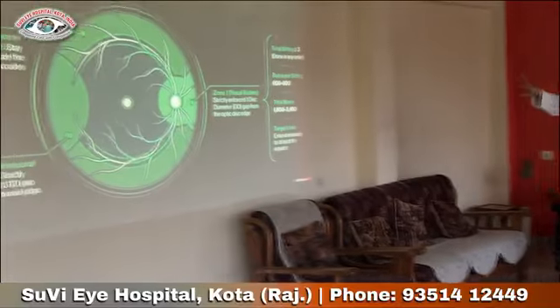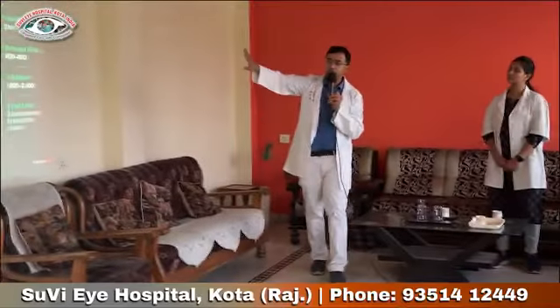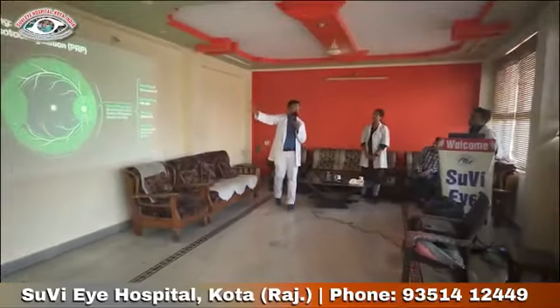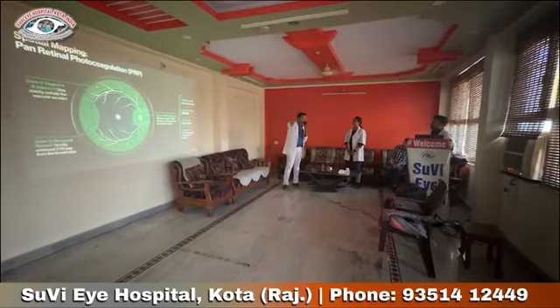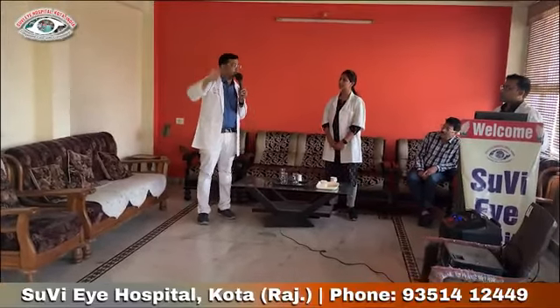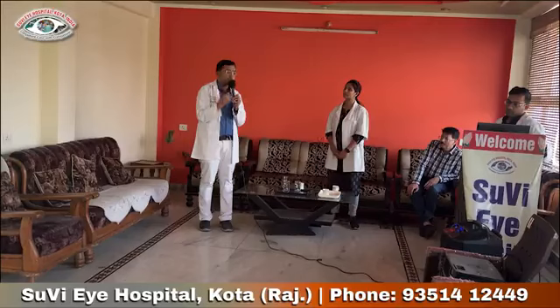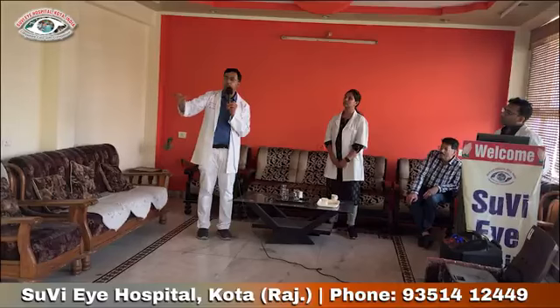So increase the number of sittings, and when there is no vitreous hemorrhage, go for the inferior nasal, or you can even cover the full inferior quadrant, 180 degrees, first. Then in the second sitting you can do the superior half, like superior nasal and superior temporal, and in the third sitting you can cover the periphery. Specifically because of the high RFT levels, to avoid the risk of exudative RD, you have to space it out. You can do it even in 3 to 4 sittings.